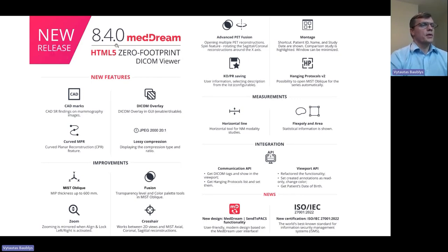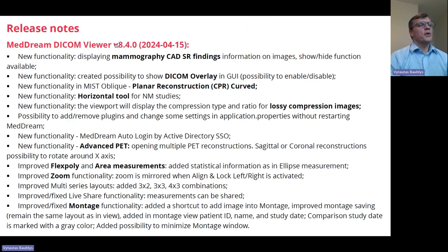As you see, the whole list of the functionality created in the 8.4 version fits only in 2 pages. This is a really significant upgrade. Later on, we will go through the detail of this functionality.